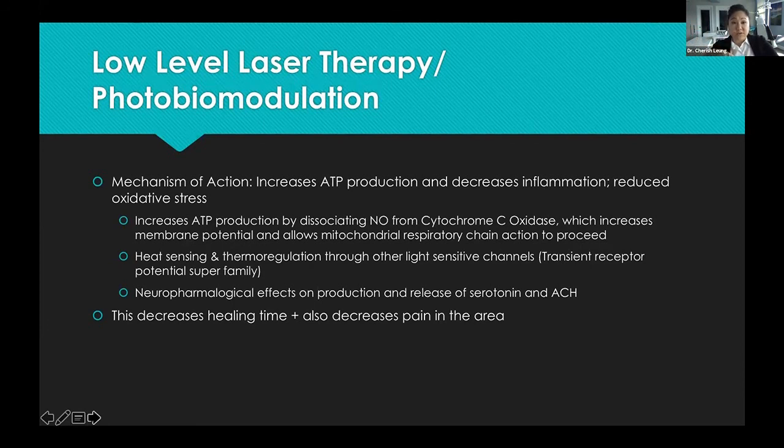so that will decrease your inflammation and reduce oxidative stress. You can also do it on any procedures that you do in the mouth, because the little red light on there allows you to do the photobiomodulation, and that will decrease your healing time, so you'll heal faster. That really helps a lot for some of these kiddos or some of the procedures. After I do frenectomies, I normally do a little bit of that laser bandage, which will give you a little bit of this as well.